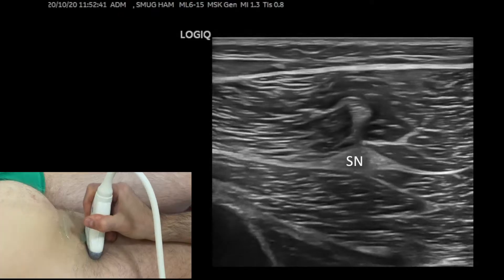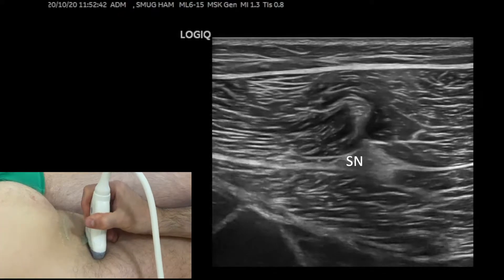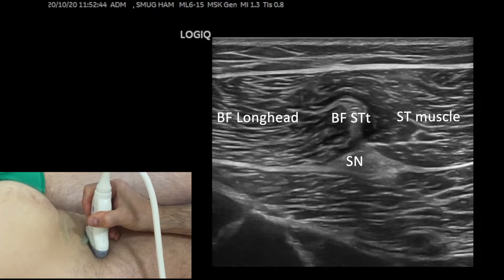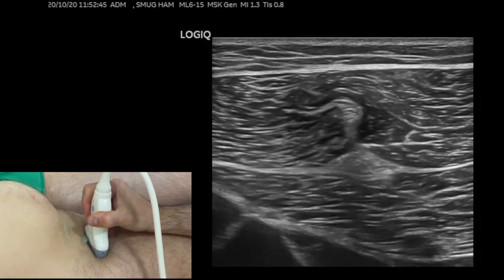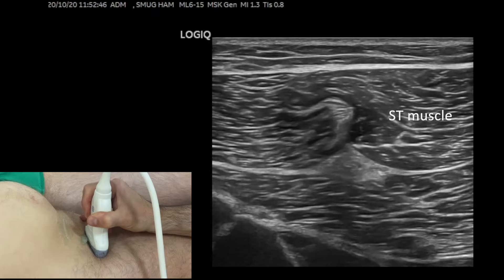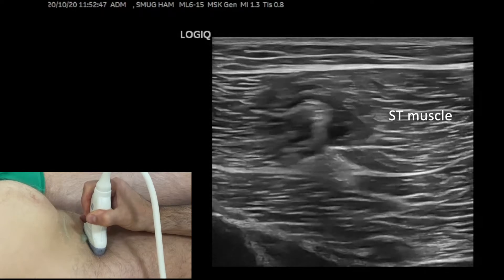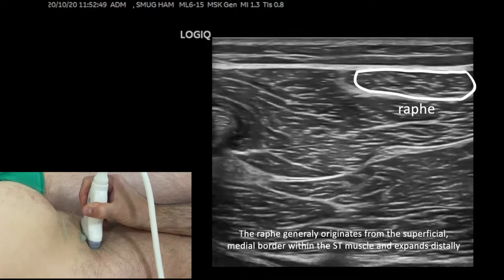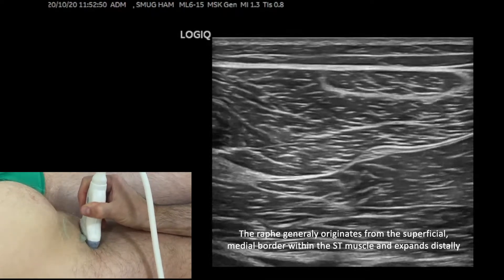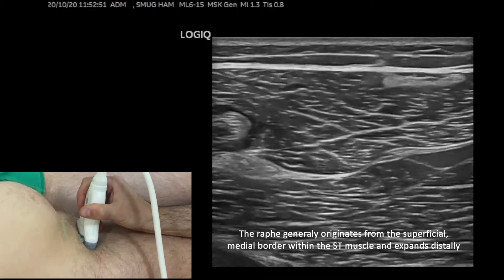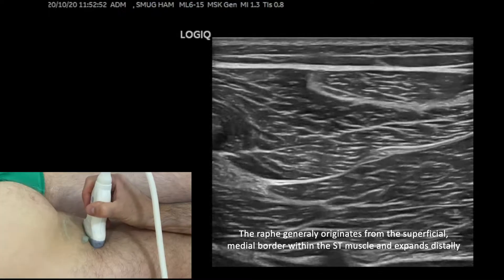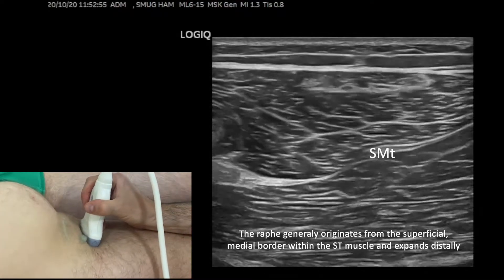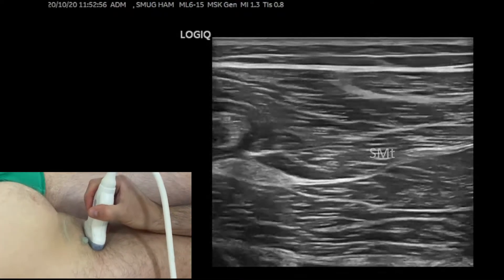Going back to the sciatic nerve — above the sciatic nerve is the conjoined tendon of the biceps and the semitendinosus. The semitendinosus is on the medial side and we can see the intramuscular architecture of the semitendinosus when we go proximal and distal.